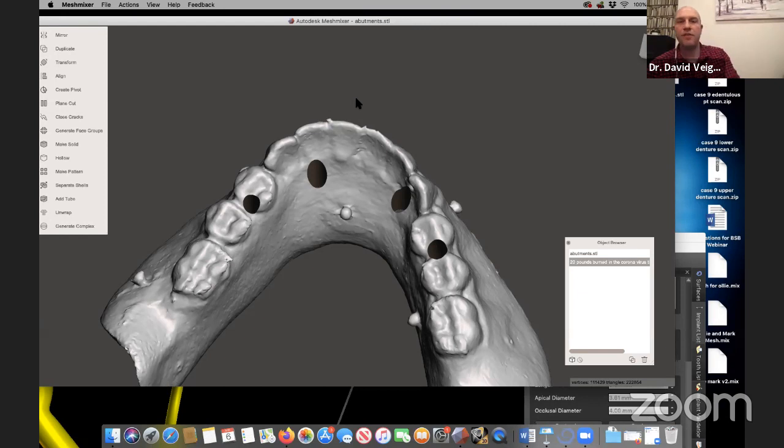The question is, how much tolerance between the drill diameter and the internal diameter of the sleeve or tube? Yes, and that is 0.1 of a millimeter. Like I was saying before, if I have a guide tube internal diameter of 5, then my drill would be 4.9 to sit inside that. So the tolerance is generally 0.1 of a millimeter.